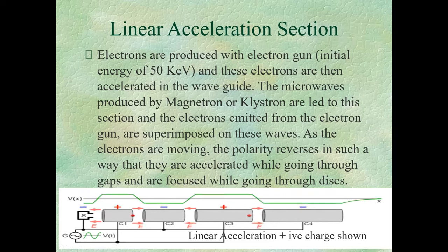multi-leaf collimators. Almost all the modern accelerators have MLCs, so we are not using blocks a lot now. And some accelerators can have MLCs as a tertiary collimator. So we have a primary, then we have secondary XY jaws, and then we might have MLCs, or some accelerators will replace one of the XY jaws and put MLCs instead of it. So MLCs can be secondary or tertiary collimators depending on the accelerator.